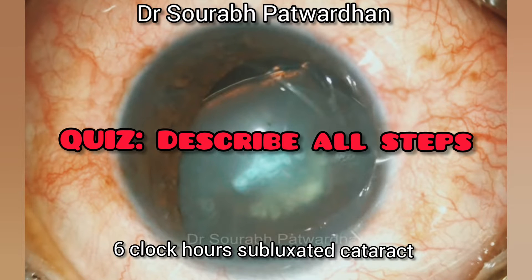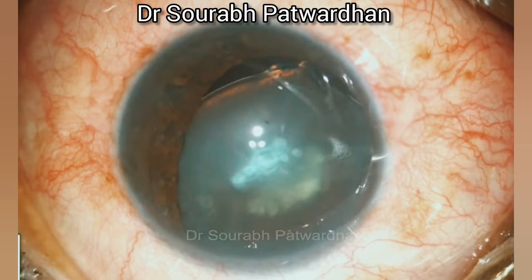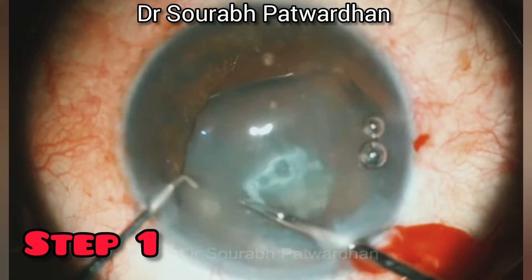Hello friends, I am Dr. Saurabh Patwadhan from Nandadi Pai Hospital FECO Training Center. In this video, this is the subluxated cataract 6 clock hours and I am going to show different steps in the form of snaps.